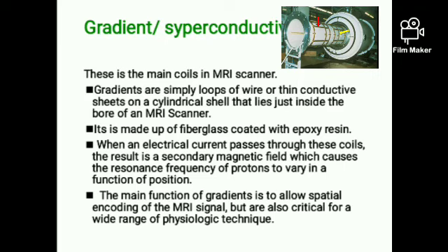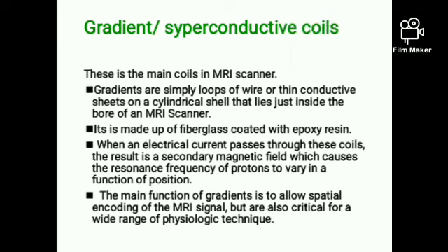When you pass an electrical current through this coil, it will produce the secondary magnetic field, which will produce resonance. What is resonance? Resonance is when something will produce or create a signal or sound when the external frequency matches with the internal frequency.